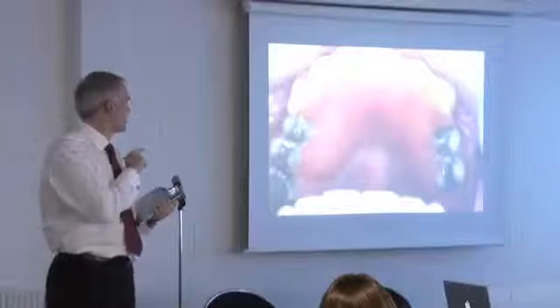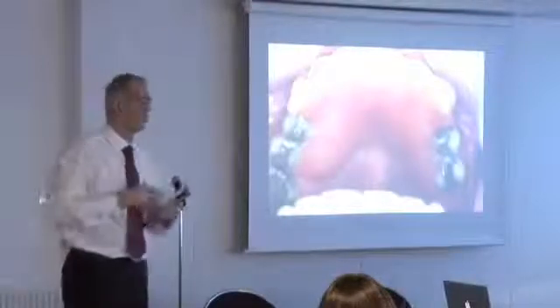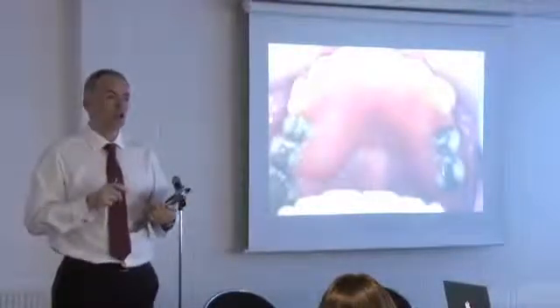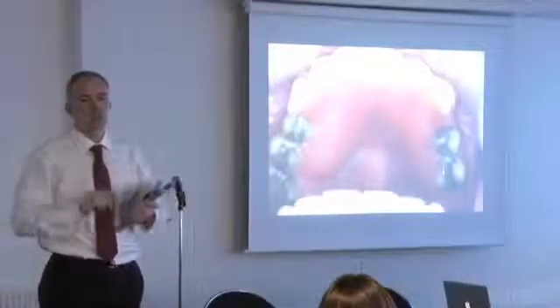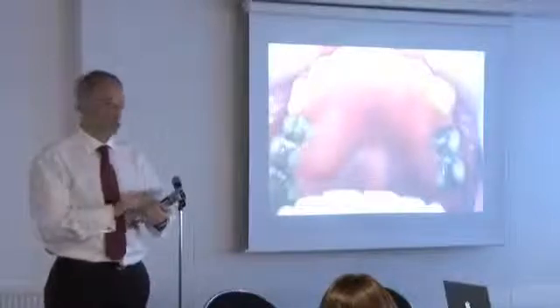So how am I going to design this denture? I've got premolars and a molar with big amalgams, and I'm going to crown them all. Literature says I should. I'm sorry, but most patients are not up for that, especially if you've got a compromised situation that's been perio around.